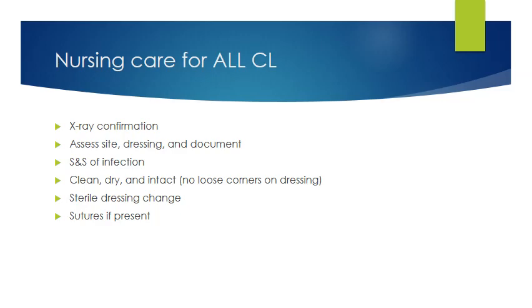Okay, so let's talk about nursing care for all central lines. Again, I've told you this already. You have to have x-ray confirmation before you can use it, so that we know that the catheter tip is where it's supposed to be. If for any reason your patient has pain or an unusual sensation, then you would want to go ahead and get another x-ray just to make sure that it hasn't dislodged.